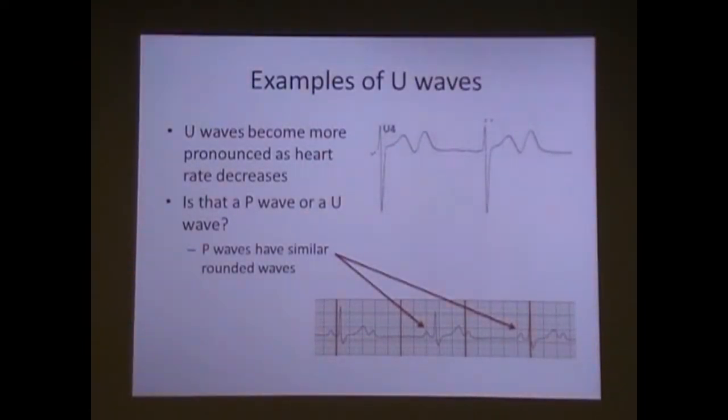Correct? Well, if I'm looking at this, I see this upward morphology with a QRS. I've got an upward morphology with a QRS. I've got an upward morphology, I think, with no QRS, so that makes me a little suspect. But when I look after the ST segment here, the T wave, that's much more rounded. So in general, that's a hard one.